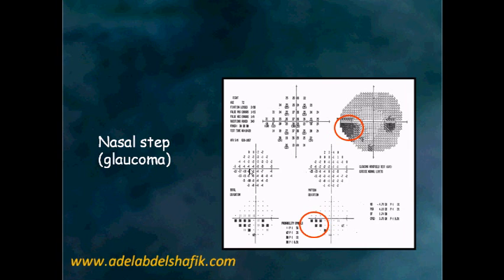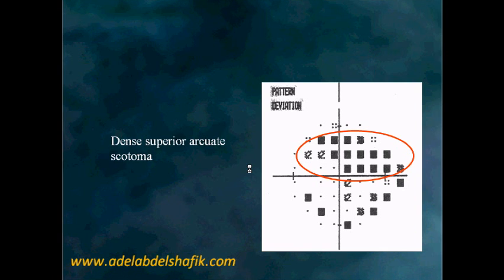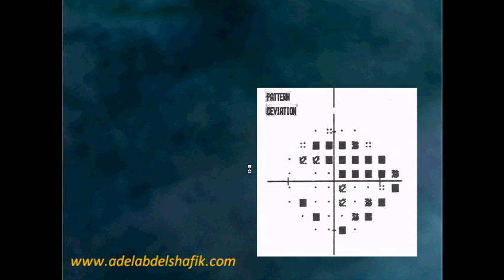It's not like what we've seen in kinetic perimetry, where we get one contraction and another that are not aligned with each other. Here we get a matrix of dots examined. So having some dots affected above and not equal dots in front of them — this is the step. You see two dots here and more dots up, so this is the step.